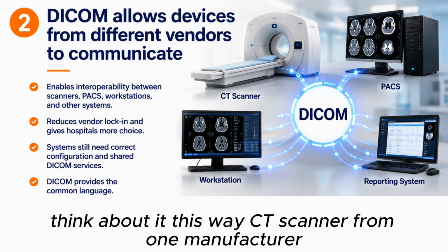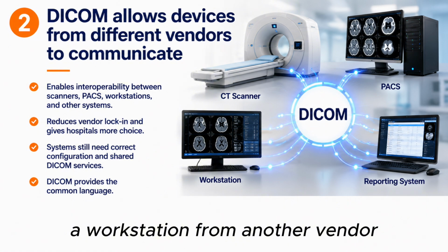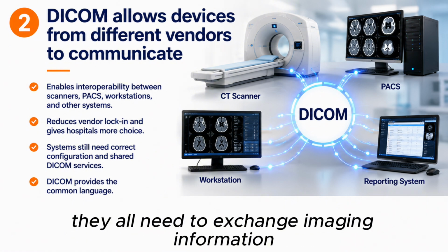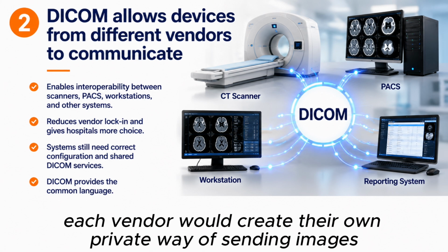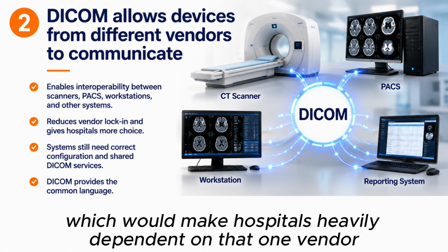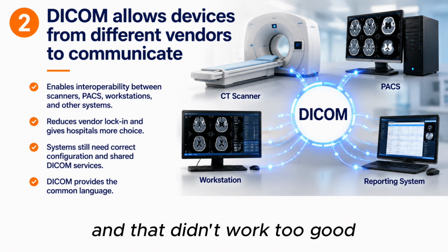A CT scanner from one manufacturer, a PACS from another manufacturer, a workstation from another vendor, and then maybe a reporting system from somewhere else. They all need to exchange imaging information. And DICOM provides just that. It provides a common set of rules so those systems can communicate. Without a standard like DICOM, each vendor would create their own private way of sending images, which would make hospitals heavily dependent on that one vendor. In fact, we saw that in the early days of digitization, and that didn't work too well.